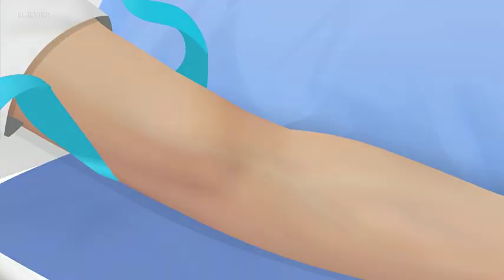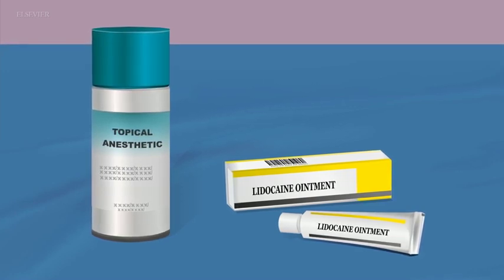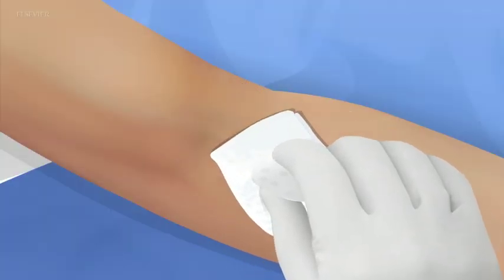Release the tourniquet. As prescribed or per the organization's practice, apply a topical anesthetic if required to reduce pain. Remove the anesthetic completely from the skin after the prescribed dwell time.